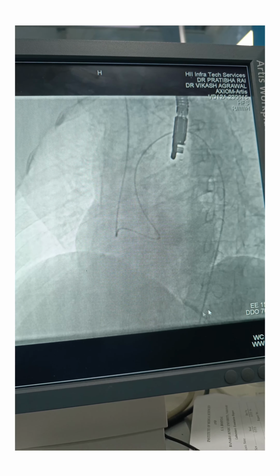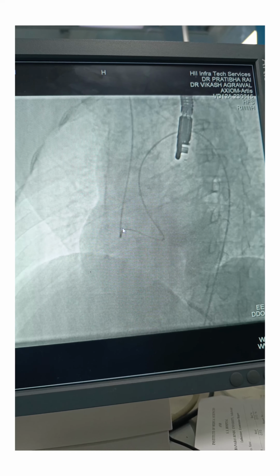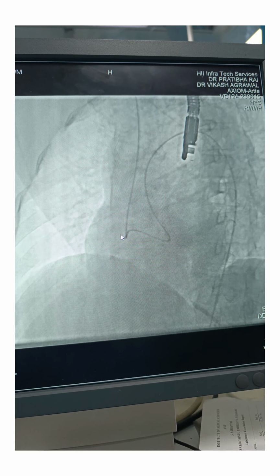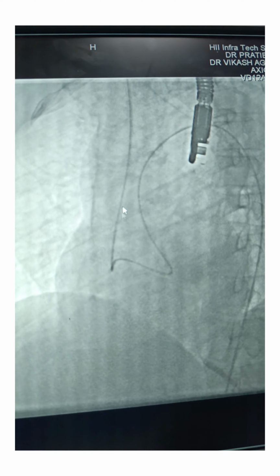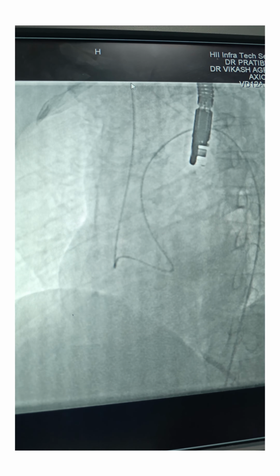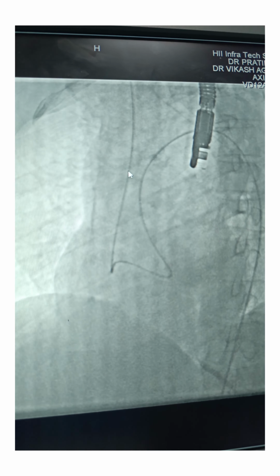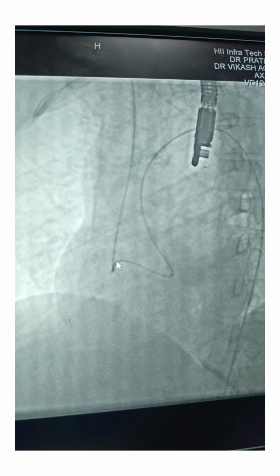So catheter course is again from the arch to LV across VSD. Now you can see this catheter course is not straight, meaning the VSD, you can imagine, is very tortuous. From here it is going to RV, then to RA, then SVC, then here from RIJV. So you were not able to take it out from the femoral vein, hence you attempted the internal jugular vein. I could take it out, but the loop was not good enough with my experience.